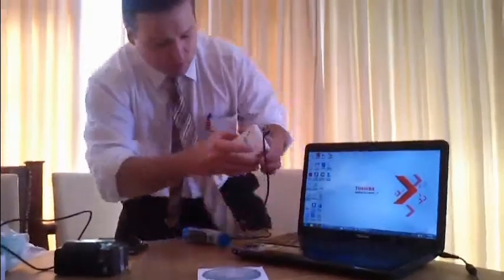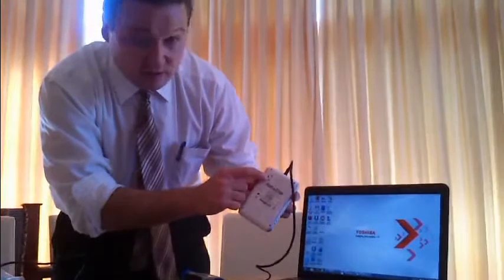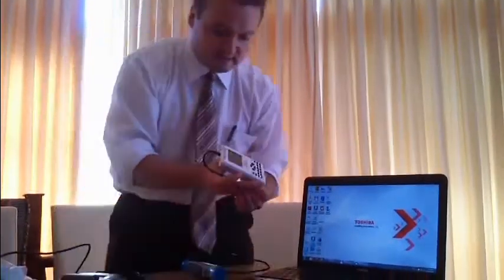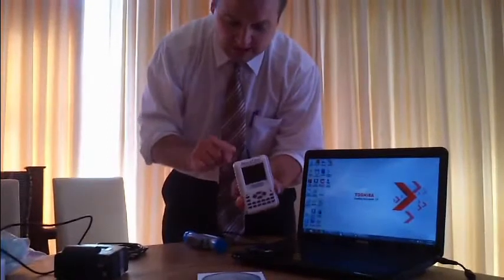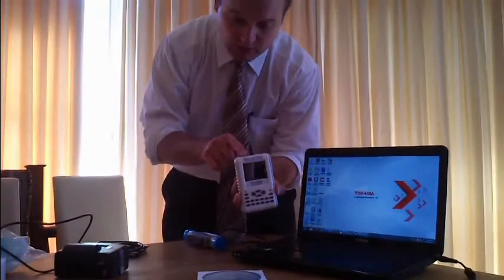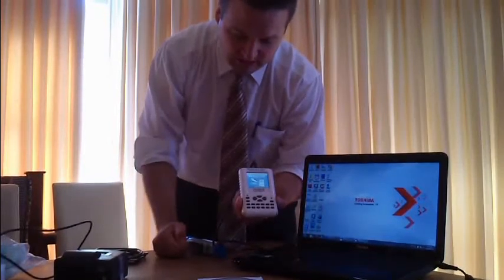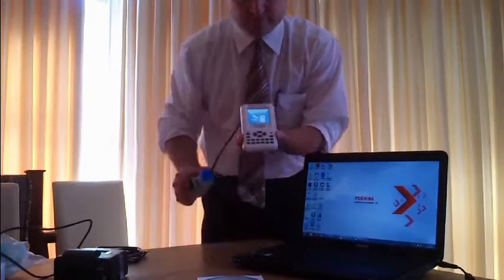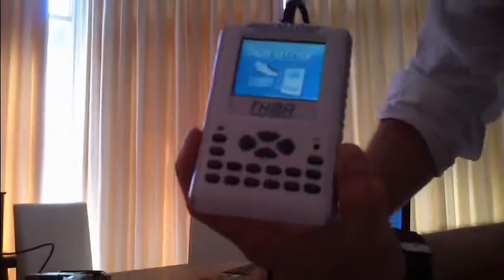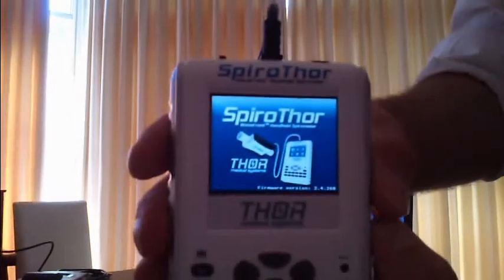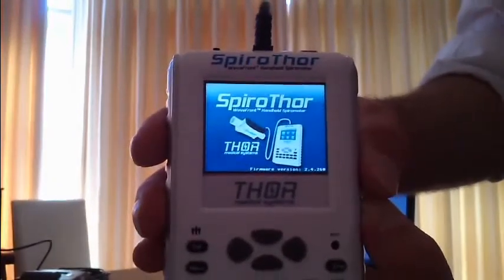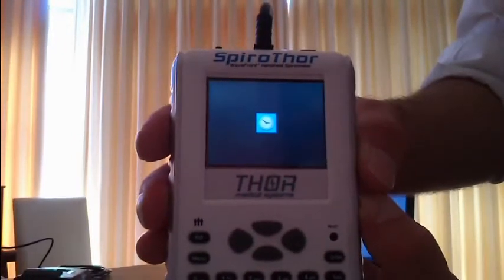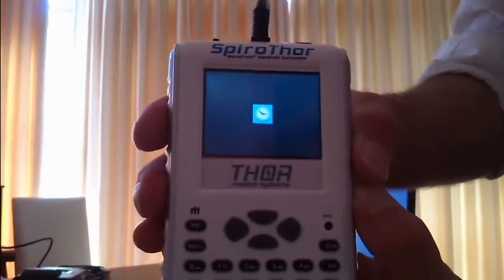It's a standalone device. There is an on-off button in the back of the device. It needs to be on. This is the main switch. This is a small computer by itself. You can start the operating system with this button on the top. I'm pressing it now. It's loading. It has a Linux operating system inside. The first thing you're going to see will be the main screen.